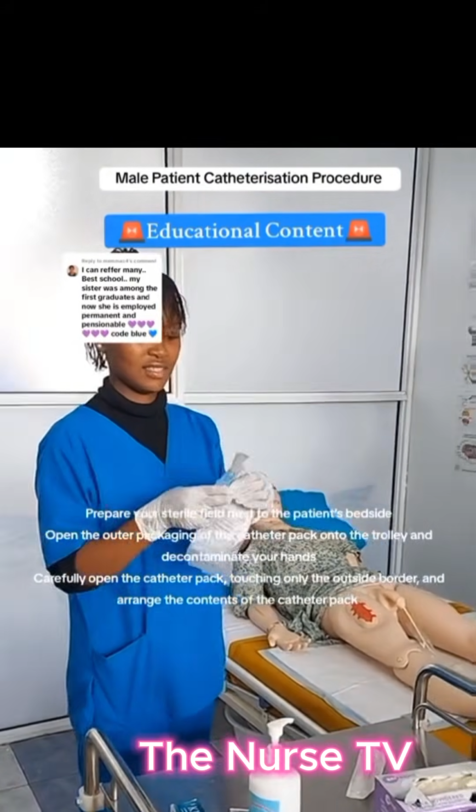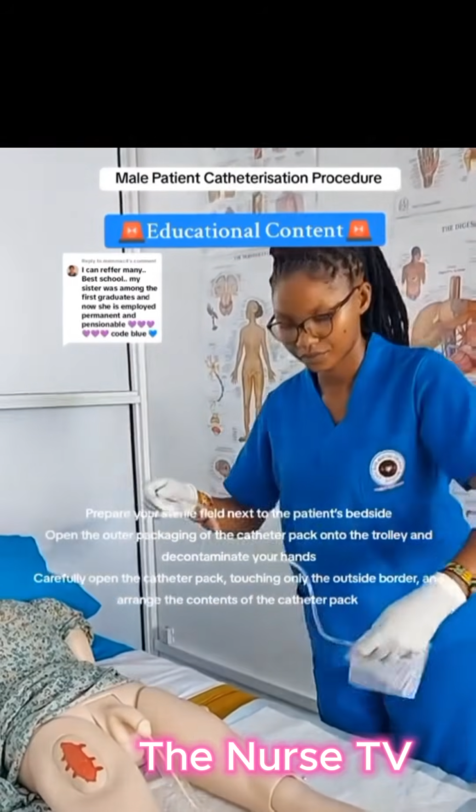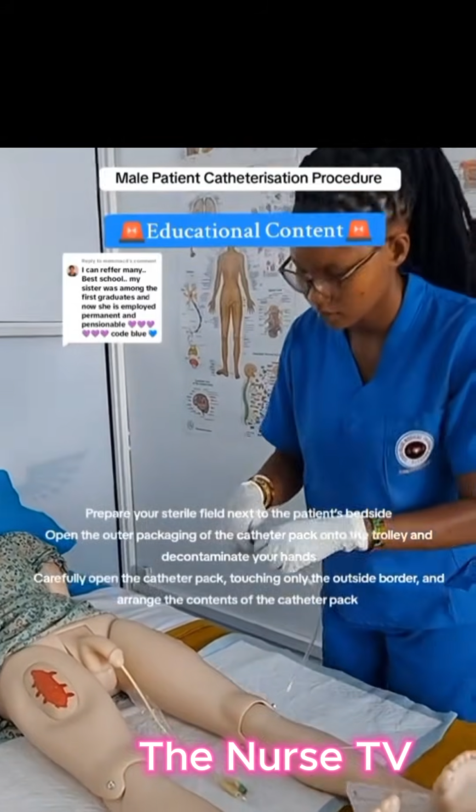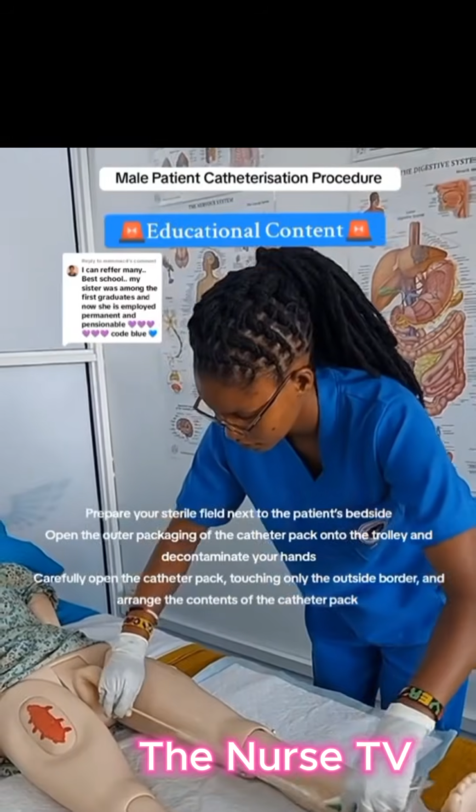Open the outer packaging of the catheter pack onto the trolley and decontaminate your hands. Carefully open the catheter pack, touching only the outside border, and arrange the contents of the catheter pack.